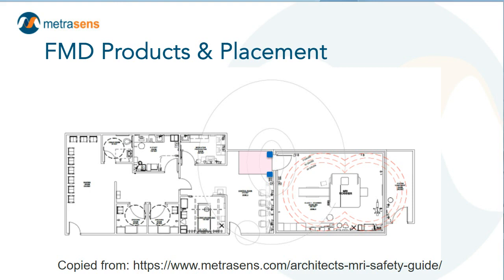However, we need to recognize that while sometimes they do catch the smaller stuff, the doorway system's real job is to find the medium and larger projectile-related threats. So if ferromagnetic detection systems are designed to screen patients, well, maybe we should have one in conjunction with the patient changing areas.